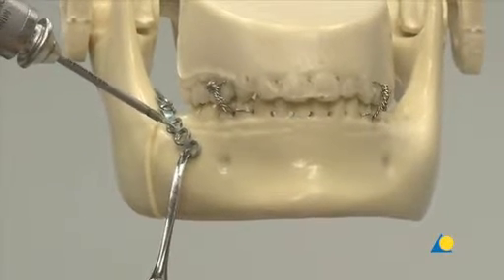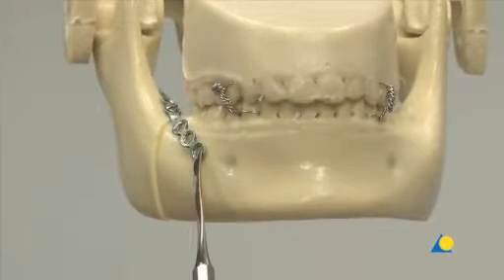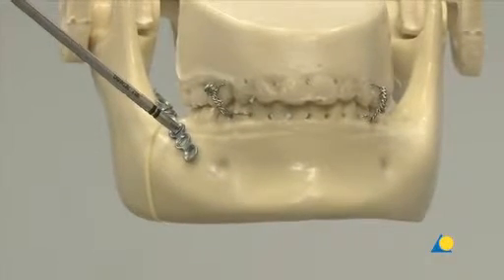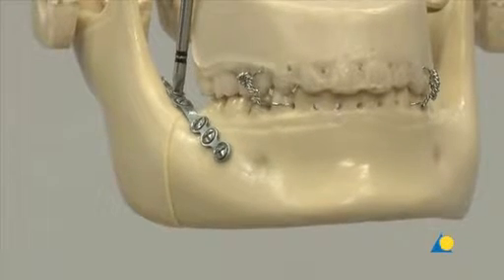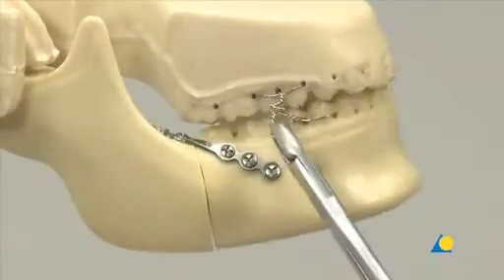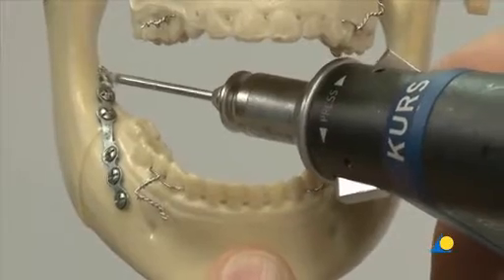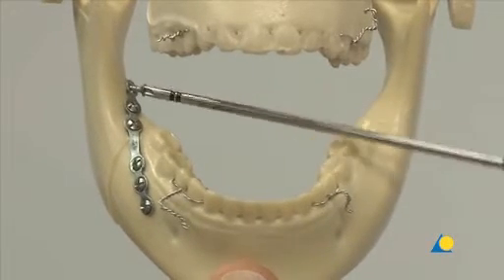The second hole is drilled anterior to the fracture. A 6 mm long 2 mm screw is inserted. The remaining screws are inserted. If the posterior hole is inaccessible due to occlusion, a screw can be inserted there after the MMF is removed. Access to the posterior screw hole is provided by opening the mouth. The remaining plate hole in the proximal segment is filled with a screw which is fully tightened.